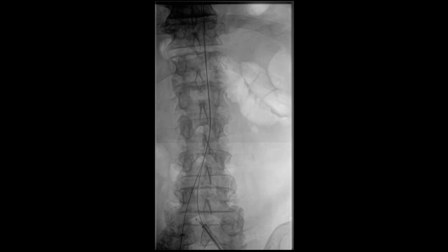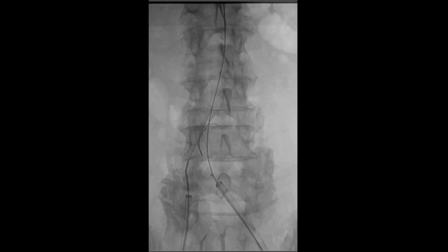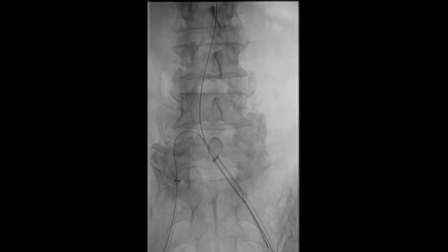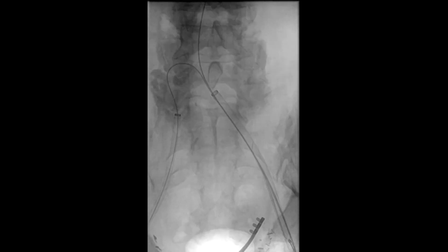We then introduced an endo snare from the left common femoral artery access site. This was done to snare a wire from the right common femoral artery, providing through and through wire access from the right common femoral to the left common femoral artery. This would later provide support for our sheath to be brought over into the left common iliac artery and to allow for placement of the internal iliac artery stent.